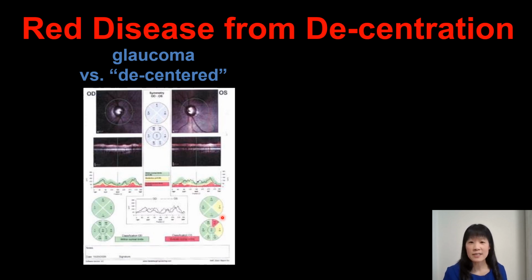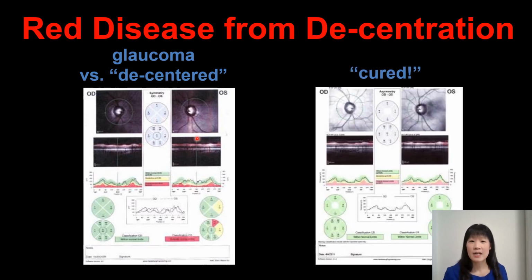And especially Teresa knows, or you know, that supratemporal is the preferential location for glaucoma. This must be real. But I took the time to look at the scan and realized that the technician had decentered the scan. So I told the technician, can you re-image the patient? So she re-imaged the patient and more carefully centered the scan. And now my normal patient is normal, not only by clinical exam, but by OCT. Everything is green.